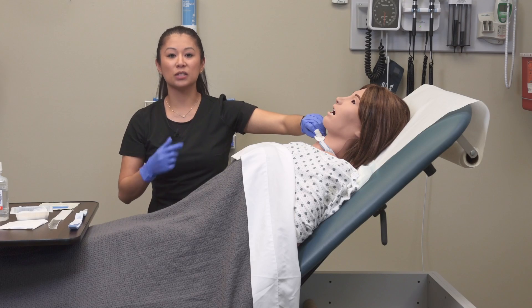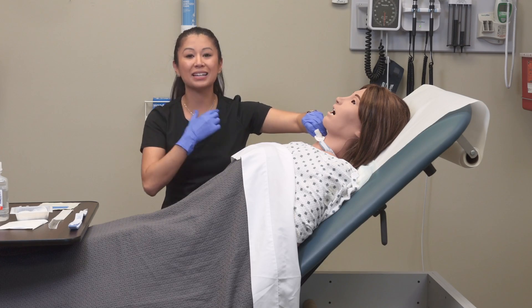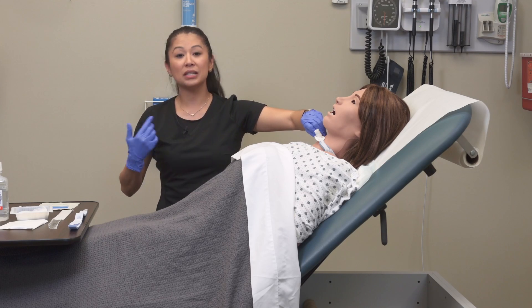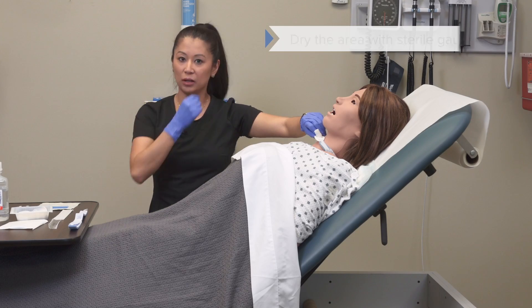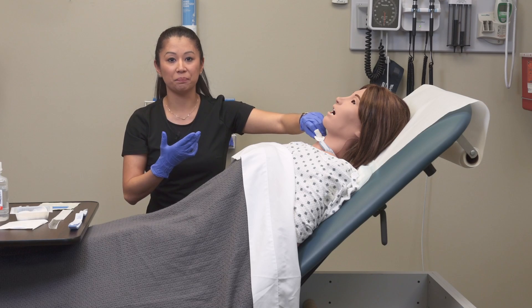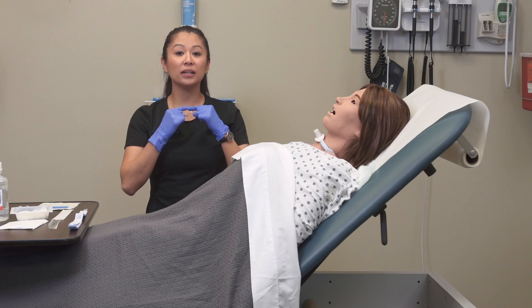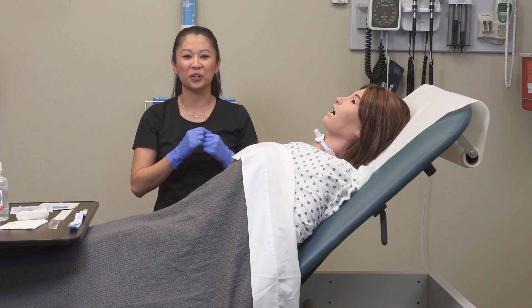Now that I've done this, we don't want all that moisture underneath the flange because it will start excoriating the skin. This is a great time to get a dry gauze and just dab the area without scrubbing the skin, because we don't want to pull and excoriate it. Now that that's all cleaned off, this is a great time to go ahead and replace that sterile split dressing underneath the flanges.